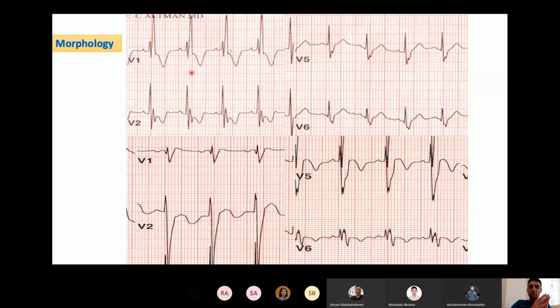So again, ECG in general, there's no memorization in it. It's all understanding. So the reason why you get RSR prime in V1 in right bundle branch block is, like we said, the septum is depolarized left to right. So when you have right bundle branch disease, your initial septal depolarization is still intact, still normal. So you still get left to right septal depolarization, and V1 being an anterior right-sided lead, you will get an initial R wave that represents your septum.